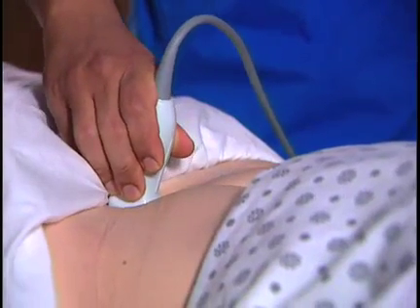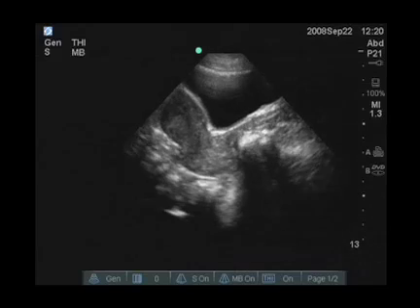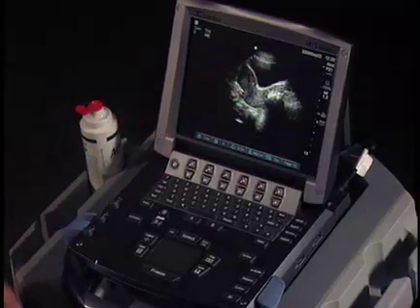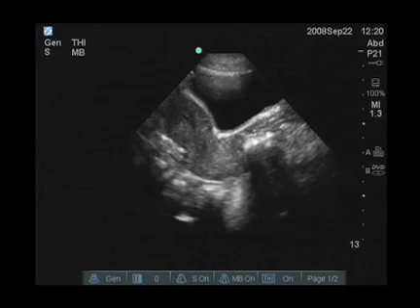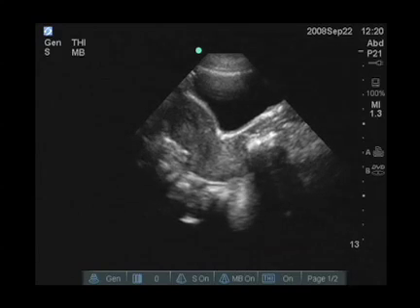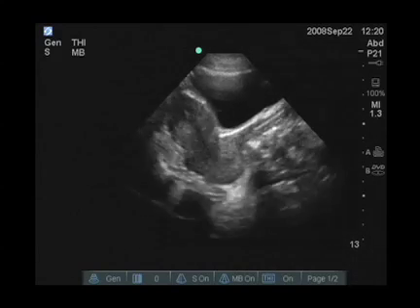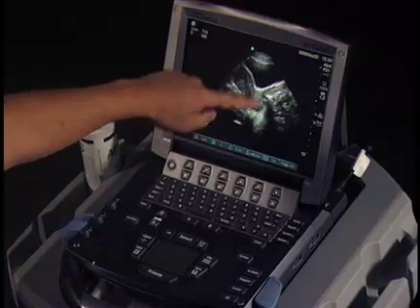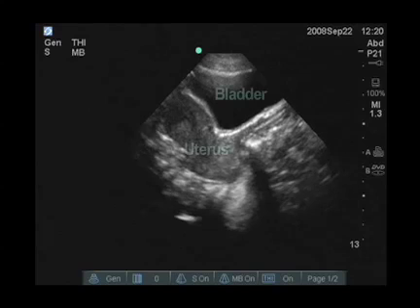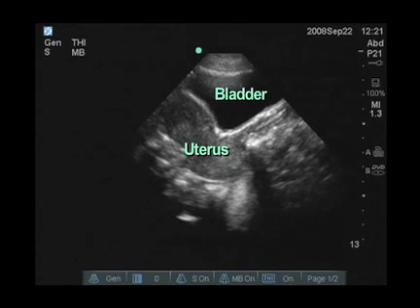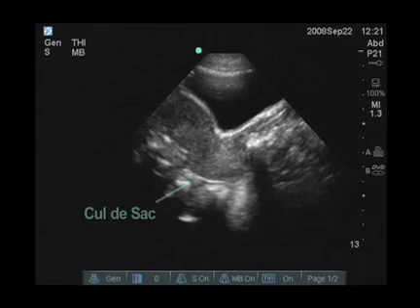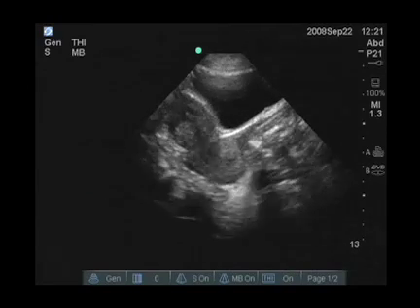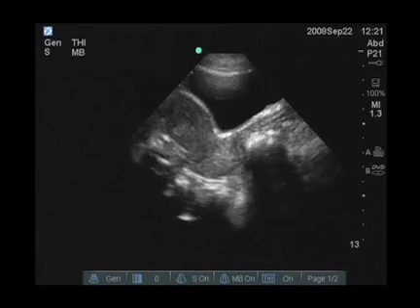We're scanning now sagittally, and some of the anatomic landmarks that we're looking at: at the very top of the screen is the bladder, which is an anechoic structure — fluid filled obviously with urine — it's got nice walls around it. Just below that is the uterus, which is a pear-shaped organ, well visualized because the bladder is full. And just below that is a potential space, the cul-de-sac, where we look carefully for small amounts of free fluid.